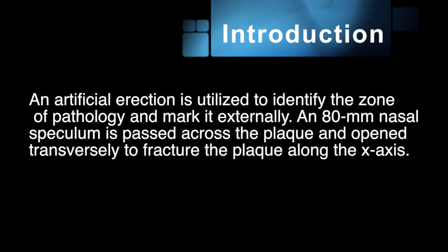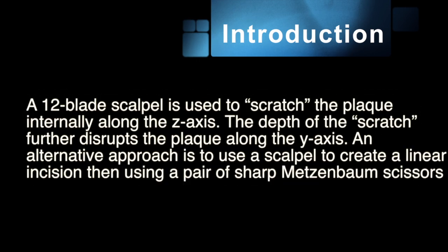An 80mm nasal speculum is then passed across the plaque and opened traversally to fracture the plaque along the x-axis. A 12-blade scalpel is used to scratch the plaque internally across the z-axis. The depth of the scratch further disrupts the plaque along the y-axis.